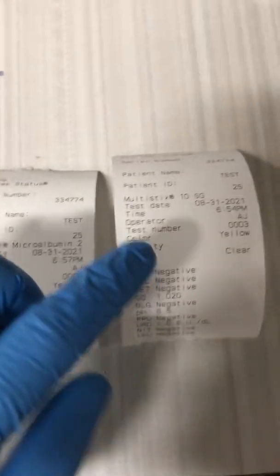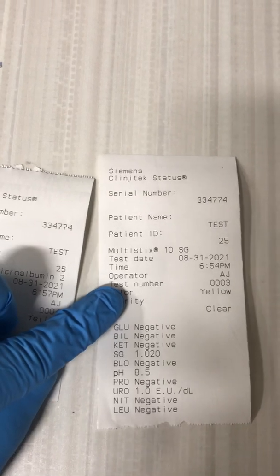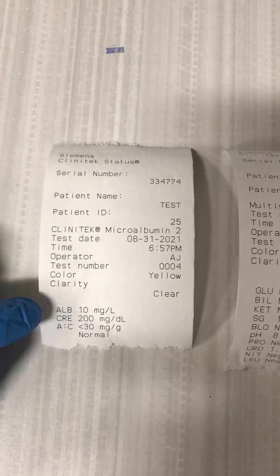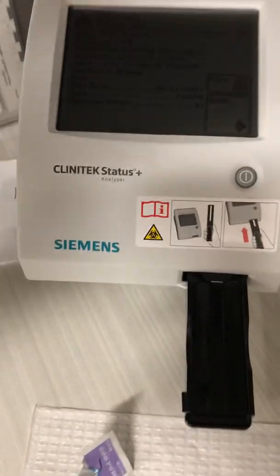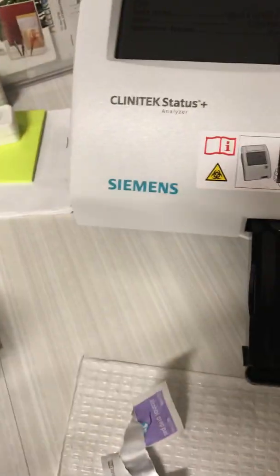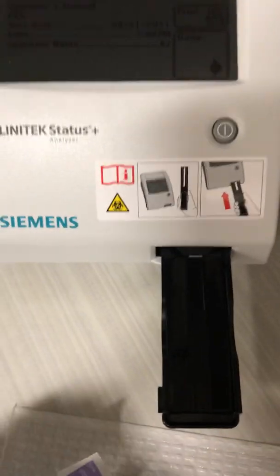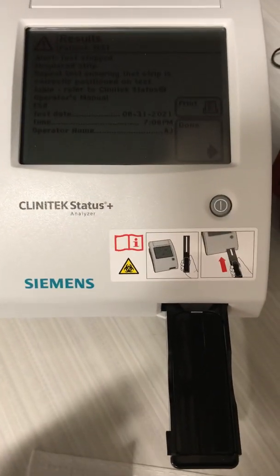This is the sample I ran earlier — a test subject with patient ID number 25. I entered the urine as yellow and clear, and it printed out the results. The urine microalbumin works the same way — you put it in and click start. The box for the urine microalbumin looks like this, so don't confuse it with the regular urine dip multi-stick. That's the end of the training. When you're finished, wipe it off again and turn the machine off. Thank you.